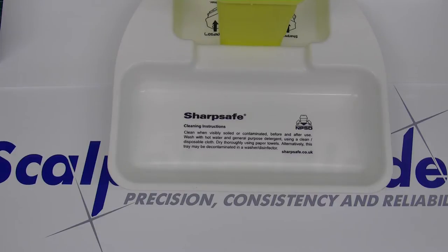This video will show the non-sterile procedure of how to fit a blade to a Swan Morton number three or number four handle. The principle of fitting a blade to either handle is the same.